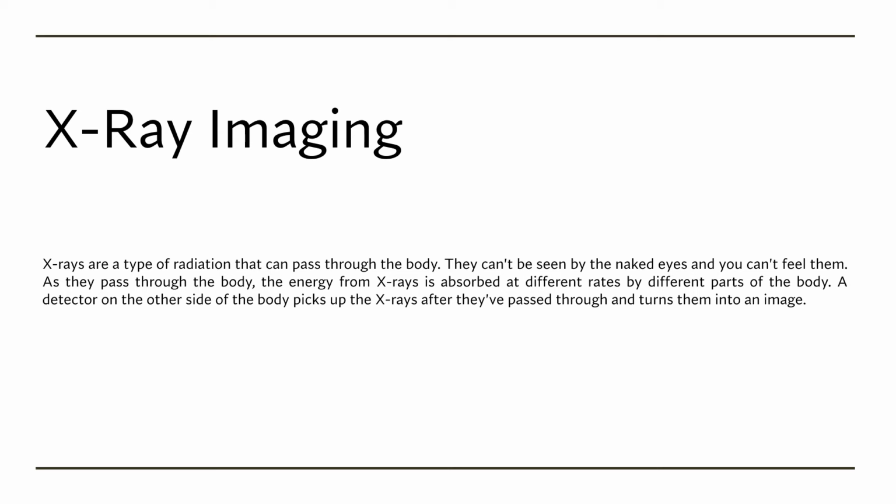They can't be seen by the naked eye, and we can't feel them as they pass through the body. The energy from the X-rays is absorbed at different rates by different parts of the body. A detector on the other side of the body picks up the X-rays after they pass through and turns them into an image.